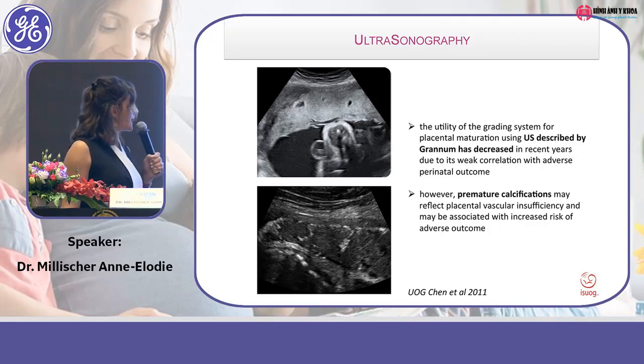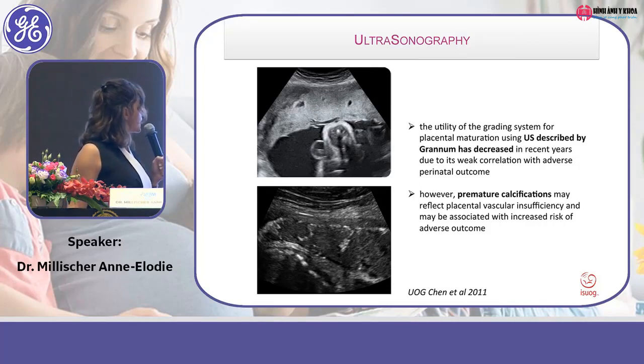What we can say and suppose is that premature calcification may reflect placental vascular insufficiency.